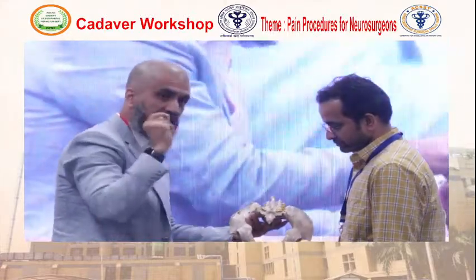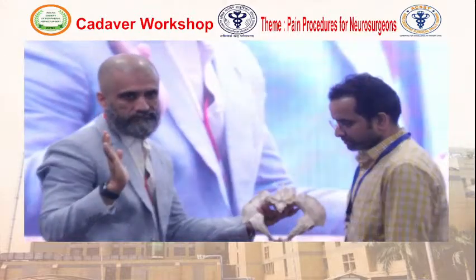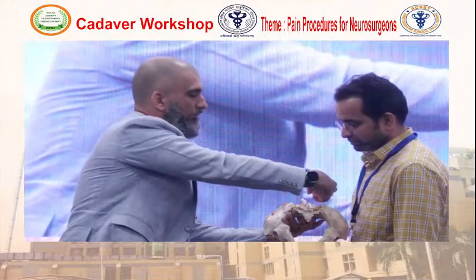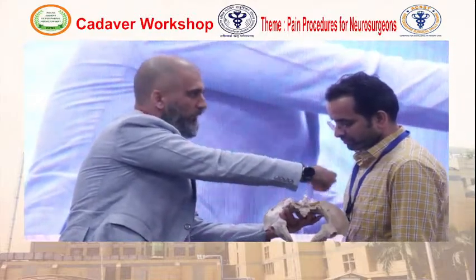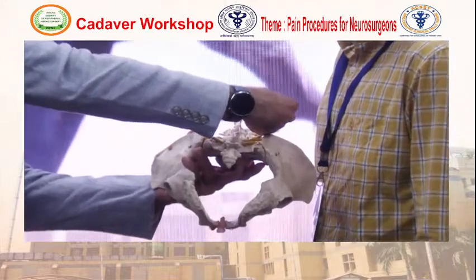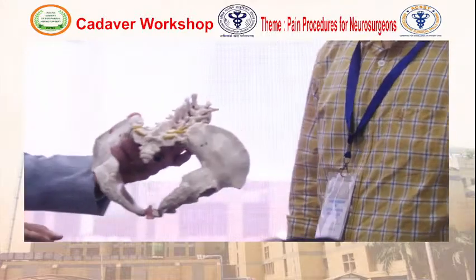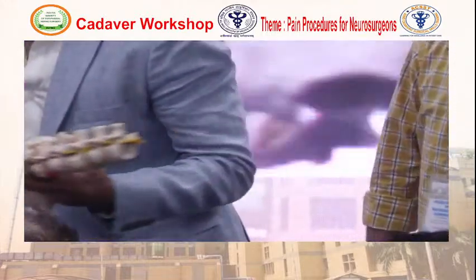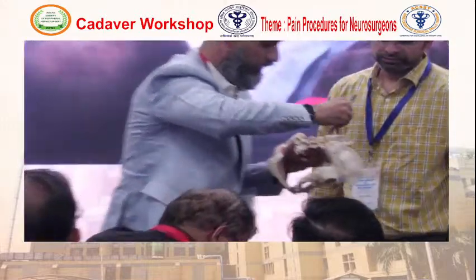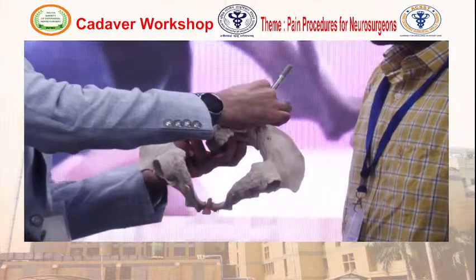Now if that concept is clear, if we have to go for sacral roots, that is the S1 root, this has to be the position of the feet. I hope you got it. So it is just AP because the direction of the foramen is like this. So the eyes are in the direction of the foramen. Any doubt? Can you take a pen to tell the direction of the foramen? This is the direction of the foramen. So this is the direction of his eye.